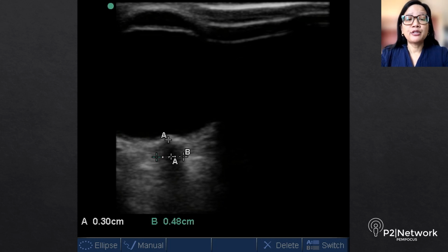The MRI confirmed elevated ICP, and within a few hours of his ED presentation, he was in the OR with neurosurgery for a ventriculostomy. So I think that this case illustrates the utility of point-of-care ultrasound measured optic nerve sheath diameter in this particular patient population: history of VP shunt with symptoms concerning for shunt failure. While it definitively doesn't say whether or not the patient has shunt malfunction, we can use it to figure out which of our patients we need to push for an expedited workup.